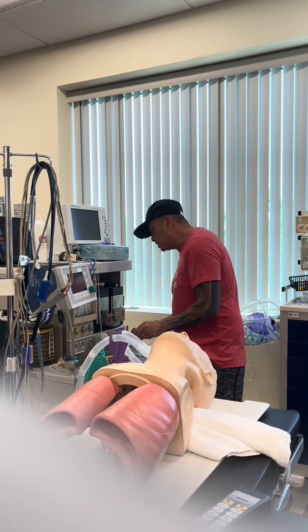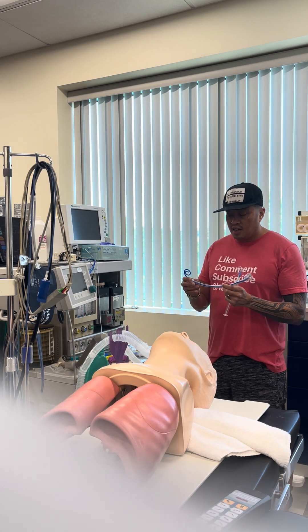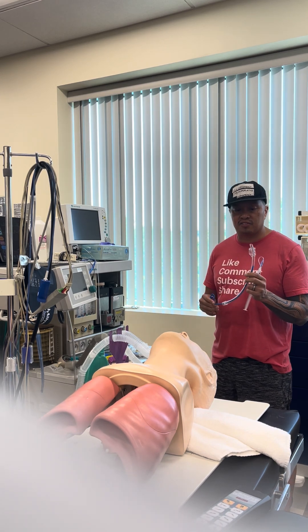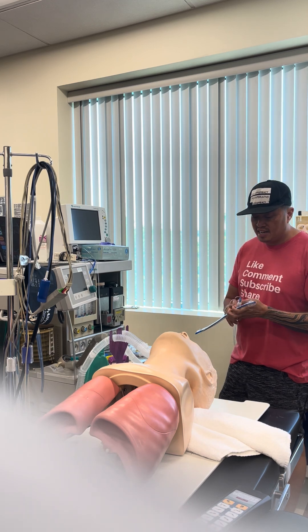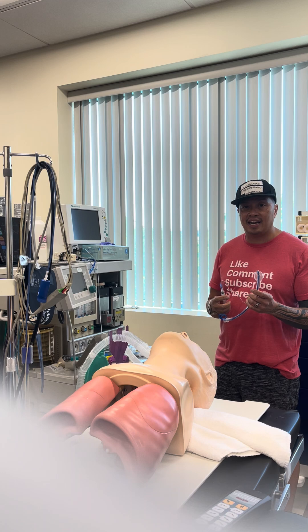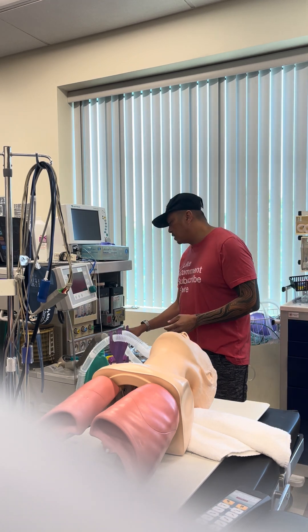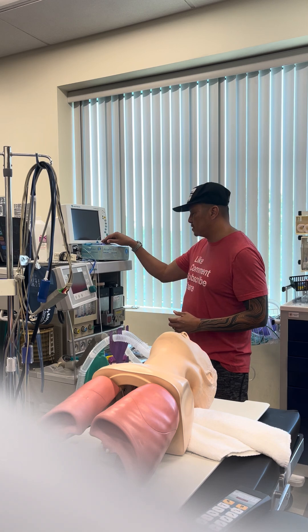Next, I'm going to check my ET tube. This is a young male, he's pretty big, so I'm going to give him a 7.5 ET tube. I have the stylet all the way up to the Murphy's eye, and I'm going to check the bubble — the air — make sure that it holds pressure, and it does. I also have a smaller ET tube for emergency purposes, just in case.